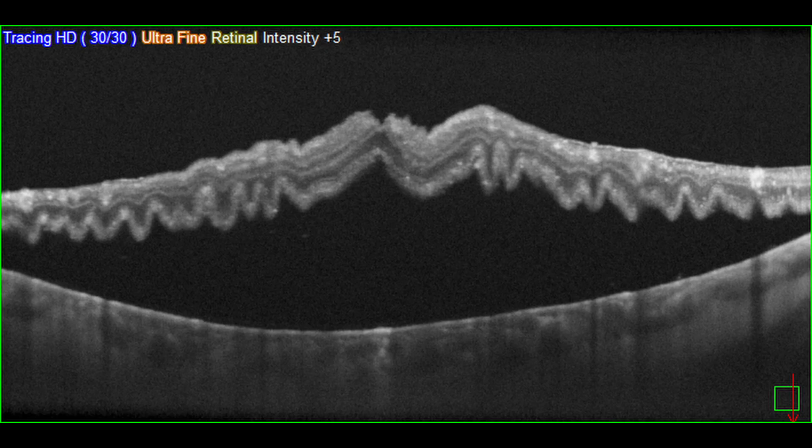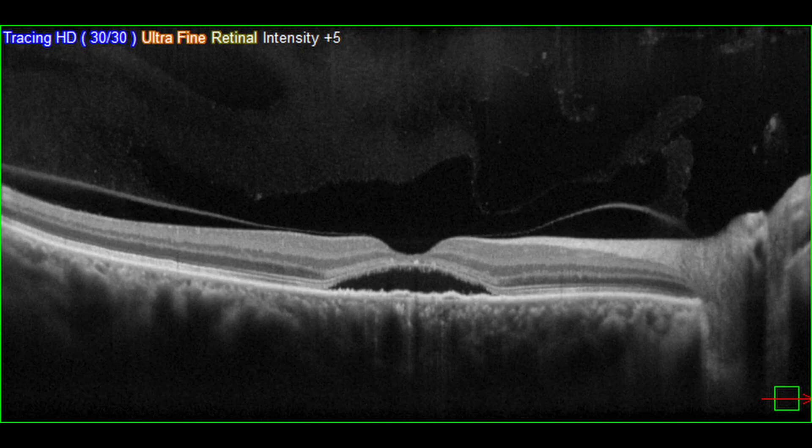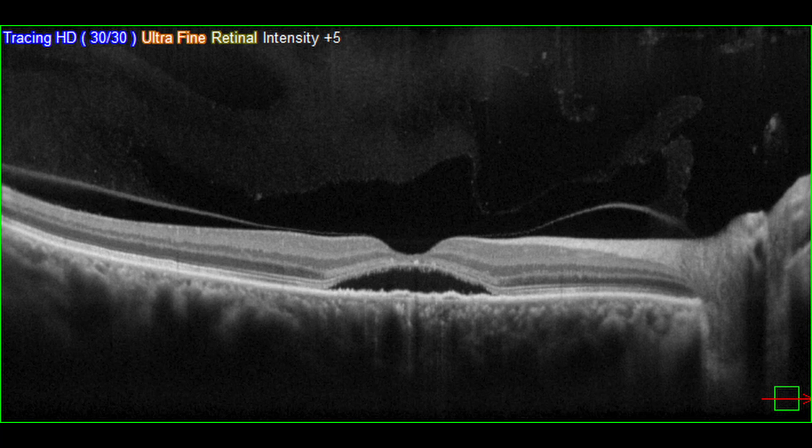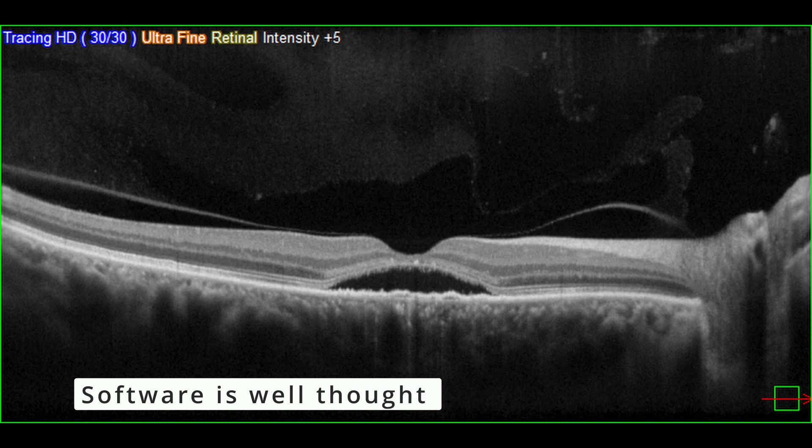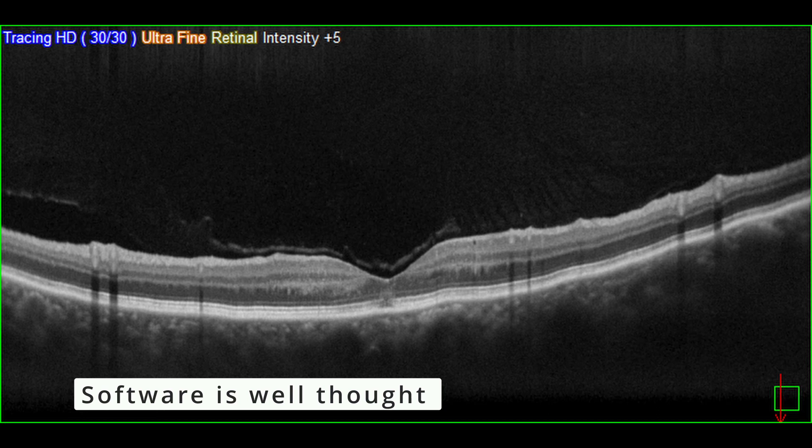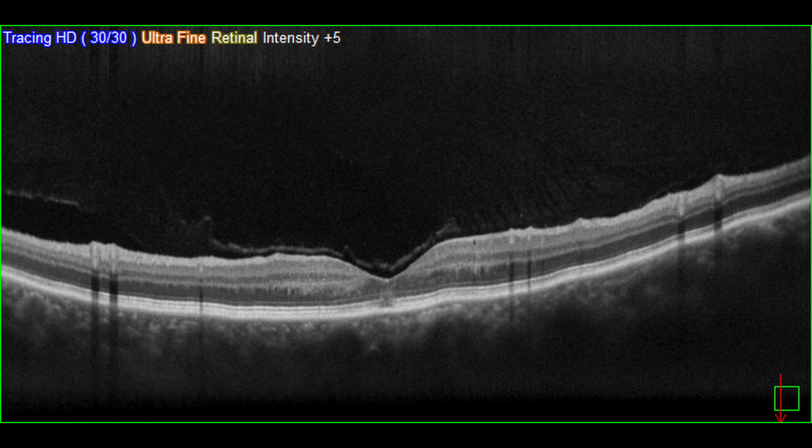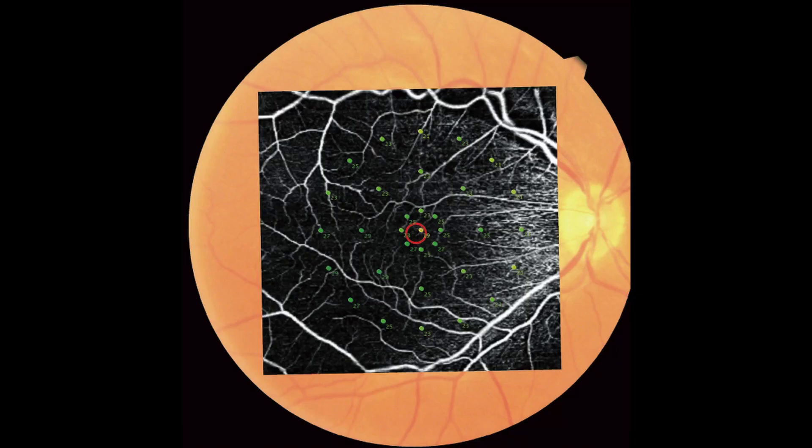What about OCT? Well OCT looks great. Like all SLO systems they have amazing quality detailed images of the B scans, while OCT angiography is really not that great. Software, you can get used to the software. It's not very difficult. It's certainly easier to operate this machine than Spectralis but it's not as easy as other automatic OCTs.